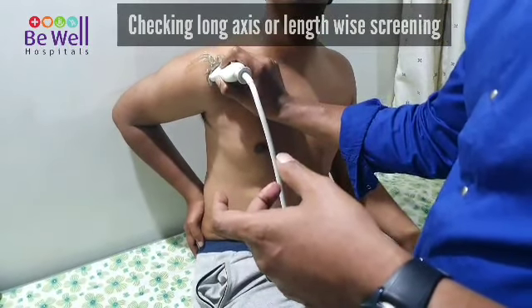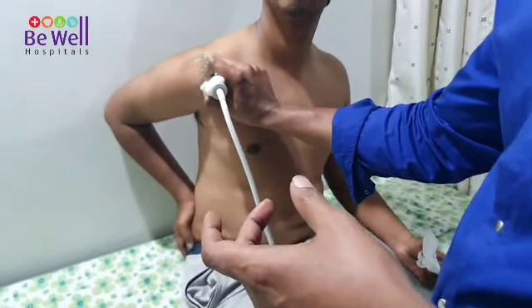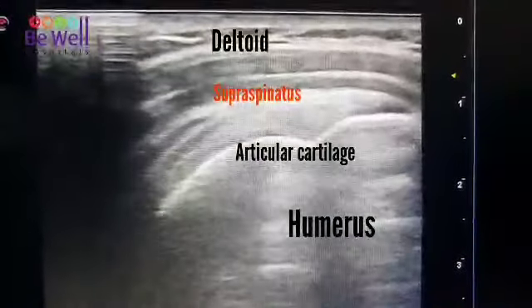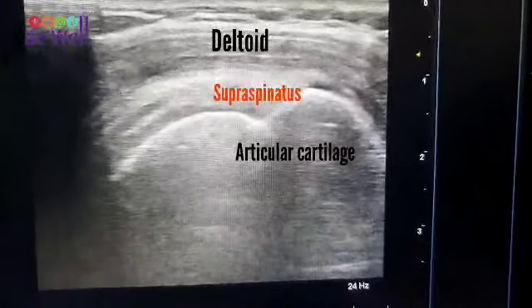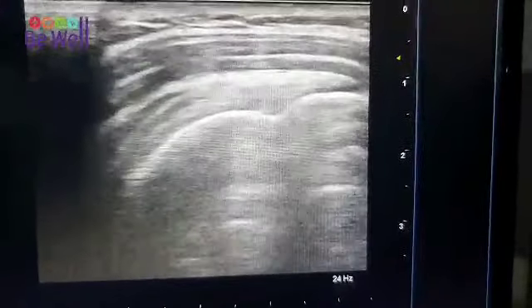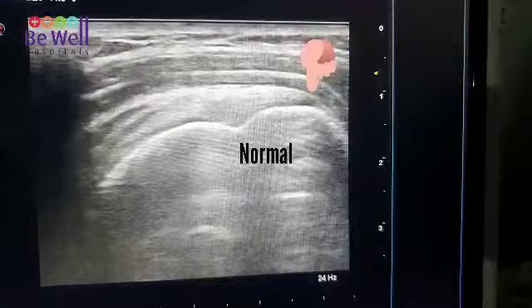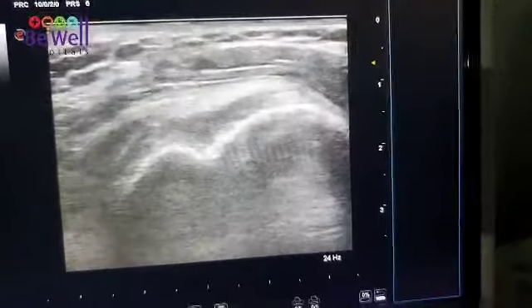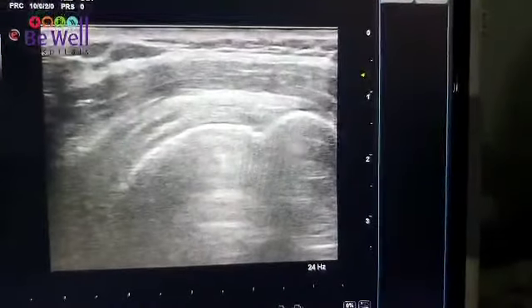As I place it, I should be able to see a very — now if you can shift onto the screen. This is a perfect example of how the supraspinatus has to look. This is the supraspinatus footprint. Now I am going through the entire length of the supraspinatus. If you can see, it is a very nice structure. The black thing you see in the front is normal anatomically. This is a completely intact supraspinatus going from top to bottom. He is a post-op patient on whom I am checking if there are any tears, but there seems to be no tears.